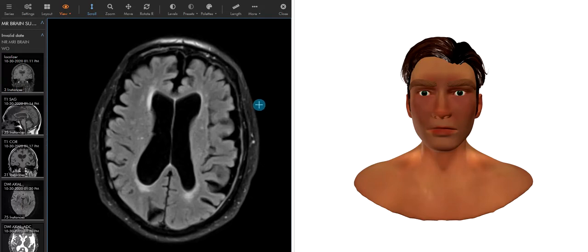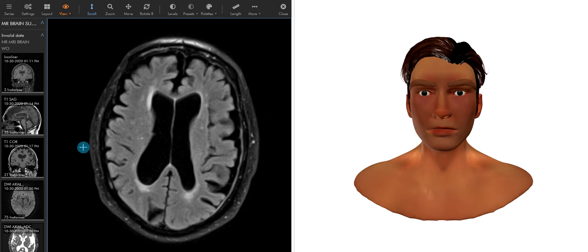Hello, let's take a look at your brain MRI. So it's my understanding that you had a recent fall and now you're having some headaches, and you had this MRI performed of your brain. This is your study here on the left side of the screen, and this is a model on the right side of the screen I'm going to use to orient you to how we're looking.